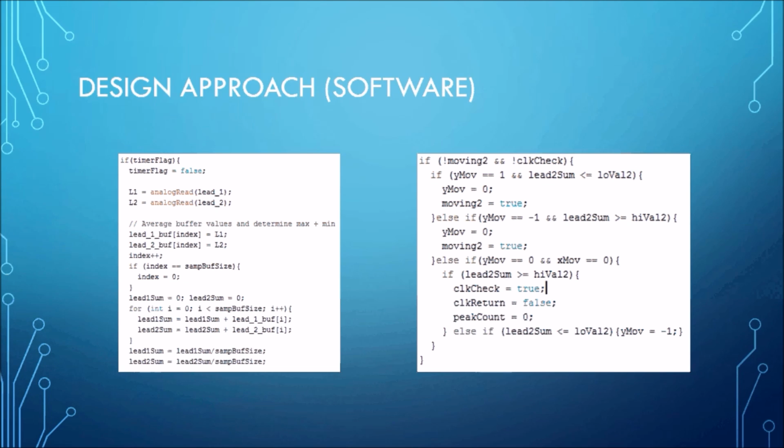Shown here is some examples of the code that was implemented in Arduino. On the left side is how the code actually reads in the values detected from the analog pins. This information passed in is then sent into a 10-point moving average filter, just to ensure that we have a more reliable signal. On the right side is an example of a state machine used to detect movement. Shown here is the Y logic, because the signal is positive for both blinks and for moving the eyes upward, it then has to also set booleans that will create more logic that will then detect peaks for clicks.